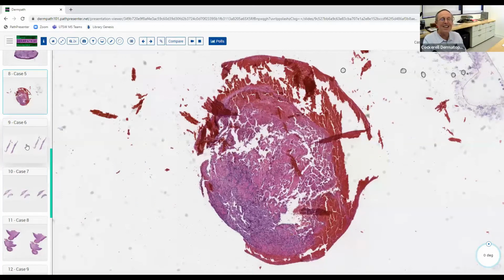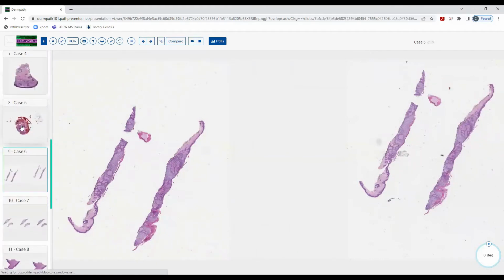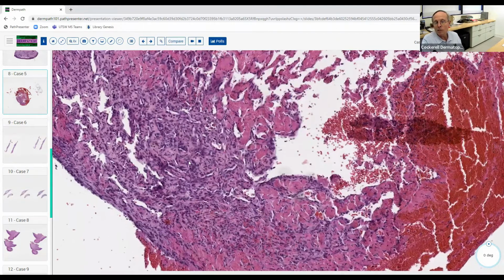Dr. Cockerell, you said it's also known as Masson hemangioma. Yeah, Masson tumor, M-A-S-S-O-N. Masson was a pretty prominent French pathologist years ago, and he described several different things. There's a Masson's blue neuronevus, and I think Masson's trichrome stain. So you've heard his name associated with other things, but he described this tumor also: Masson's intravascular papillary endothelial hyperplasia. It's really just an intravascular blood clot that's organizing, and when it forms a pyogenic granuloma, you refer to it as Masson's lesion, like here.